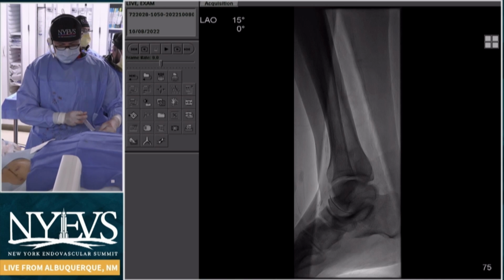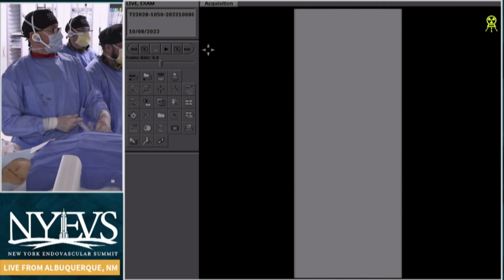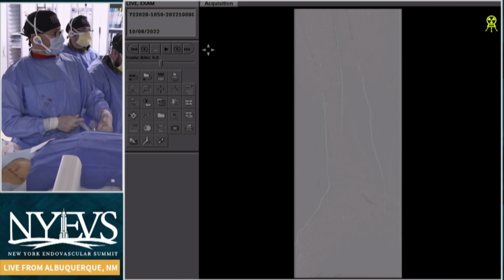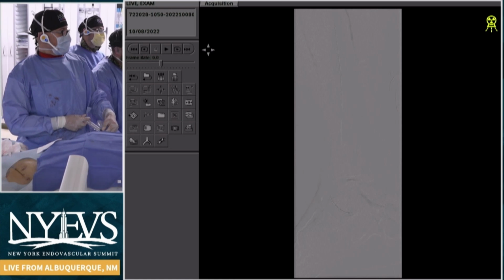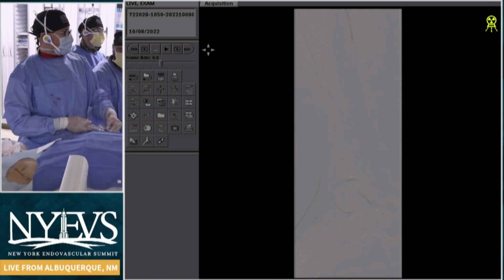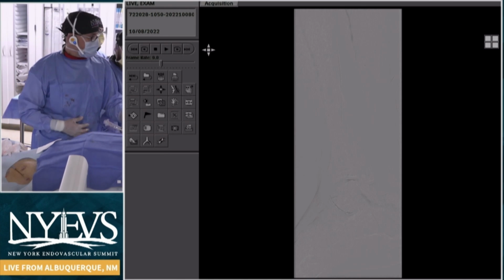We had a question about the sheath, is it occlusive? Typically, the sheath we're putting in, we're making sure that we're putting it in a normal segment of that popliteal artery. So if the P3 segment is diseased or narrowed, I wouldn't put it in there. So you can see, the question about clarity, I'm looking at medial and lateral plantars and tarsals, and you can get a sense that it looks good.